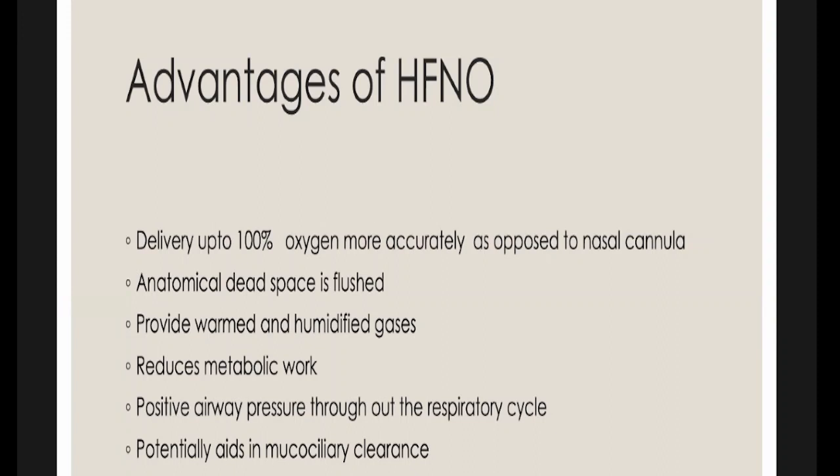Okay. How does a nasal cannula work, by the way? Sahani, what is the mechanism? How does it give us oxygen?